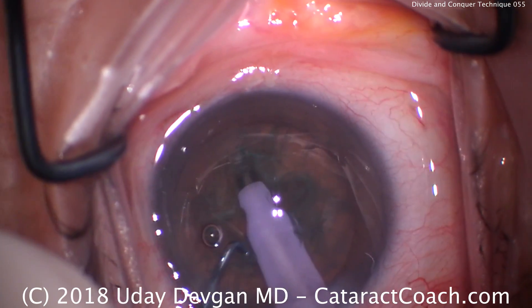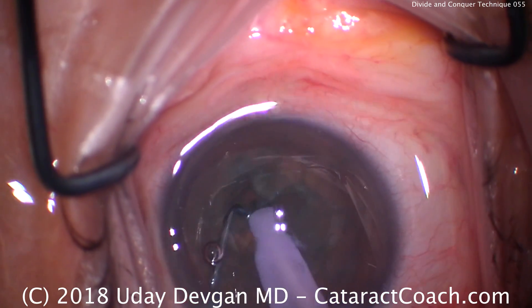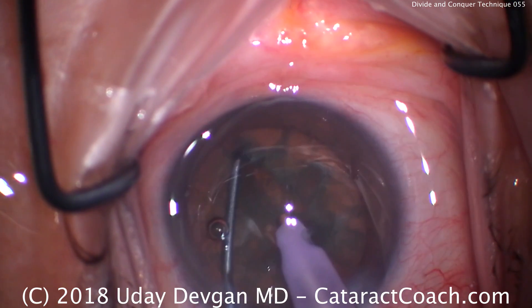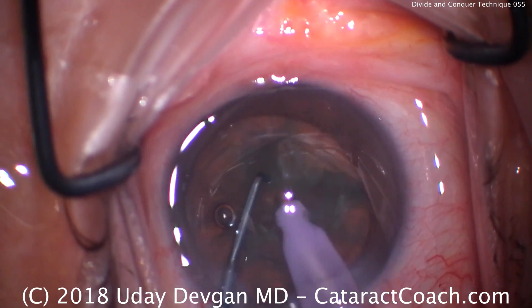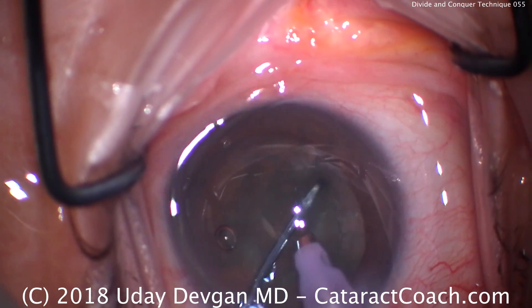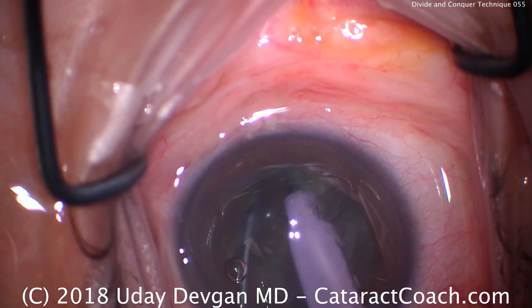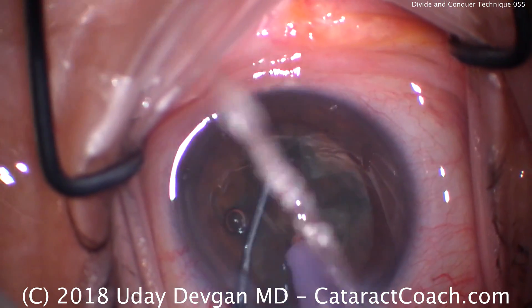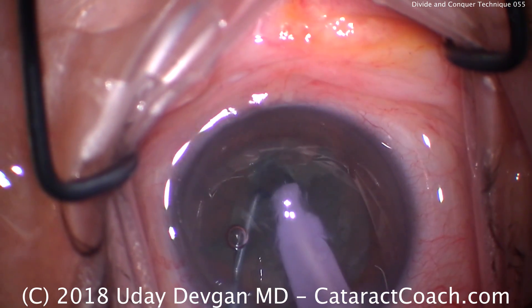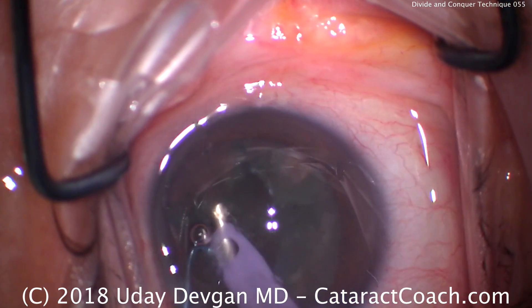All that's left now is to split the nucleus. Put the two instruments deep in the groove and push apart. Rotate 90 degrees, insert deep in the groove and push apart. Rotate again 90 degrees, instruments deep in the groove and push apart. Rotate a little bit more, then finally come back here, deepen the groove and push apart. Now we have four complete quadrants. We'll go to high vacuum setting, high flow.